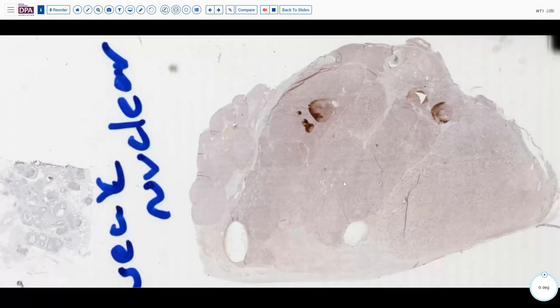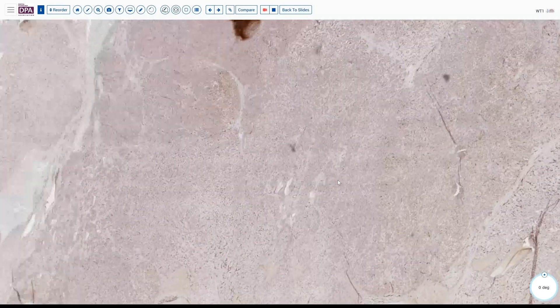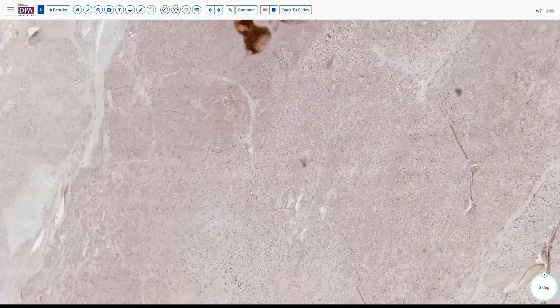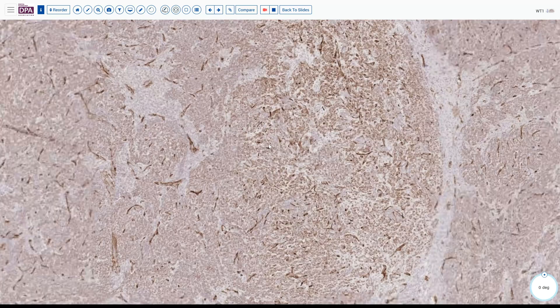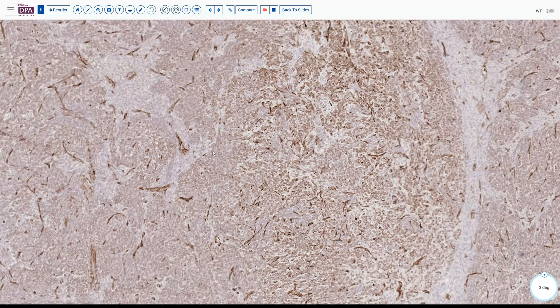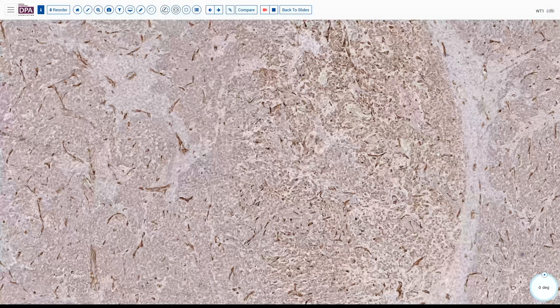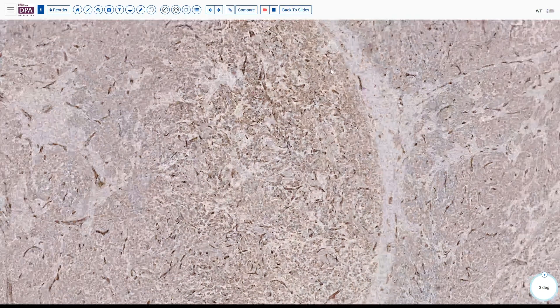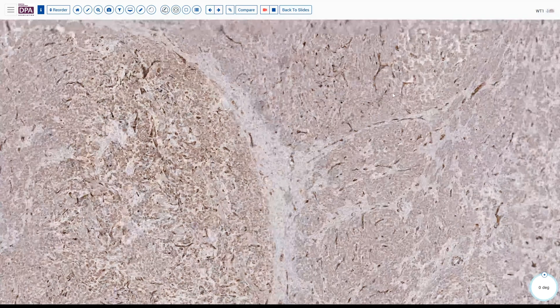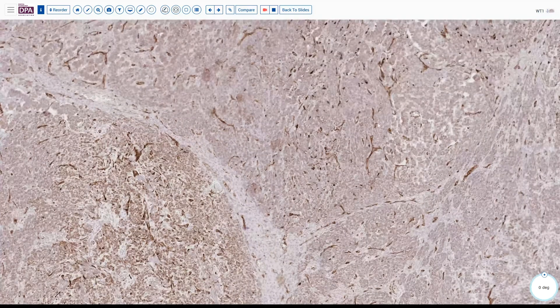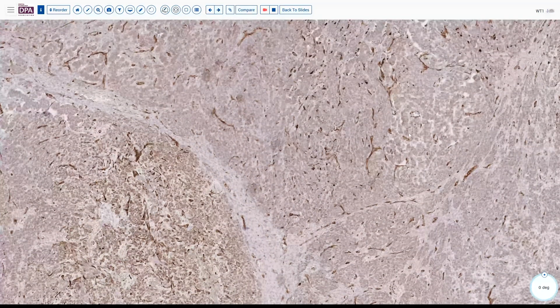Likewise, WT1 shows a very weak but positive stain, with some nice nuclear staining of many of these areas. Again, there is a slight differential between the Sertoli component and the stromal component in between, also highlighting the vessels interestingly.